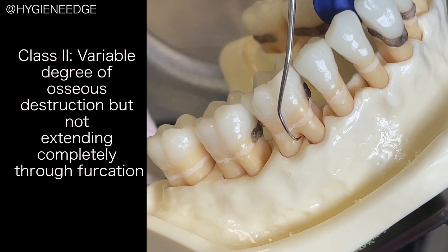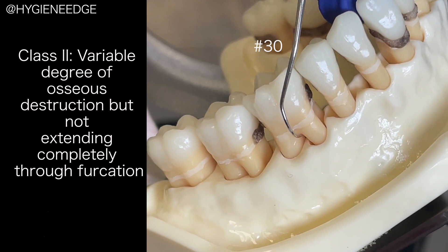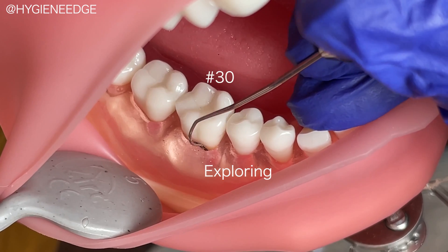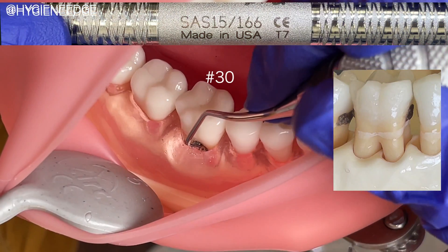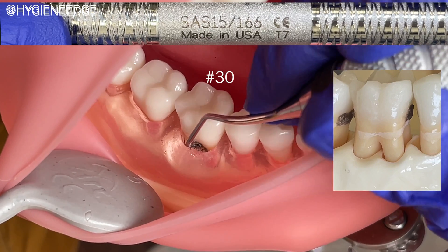For a more advanced furcation like a class 2, using a longer shanked instrument like a Gracie is key. A toe is needed to protect the cementum since we're working on this softer tooth structure. Since these class 2 furcations are covered with gingival tissue, instrumentation is all completely by feel.